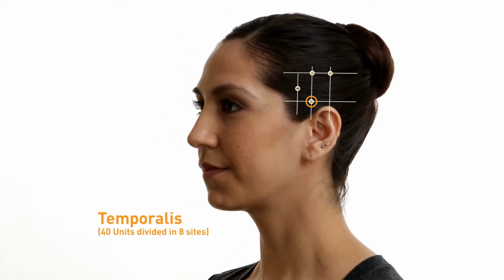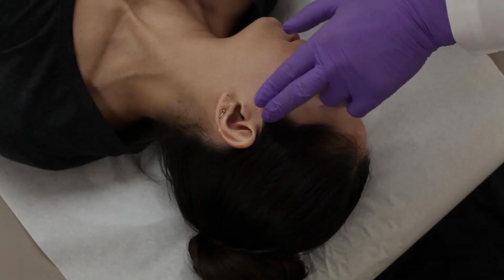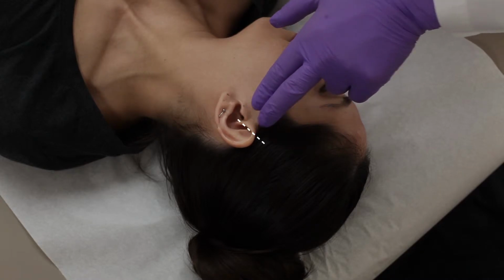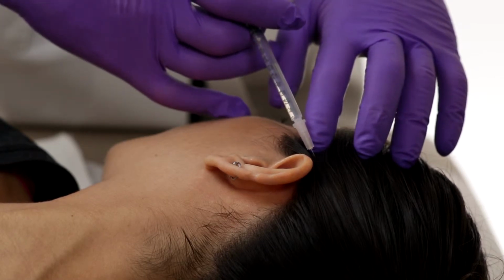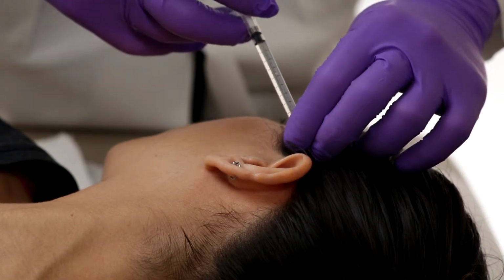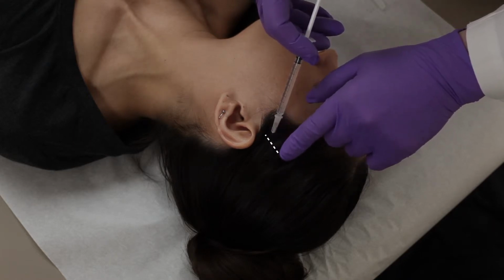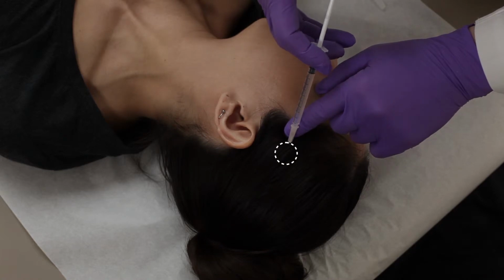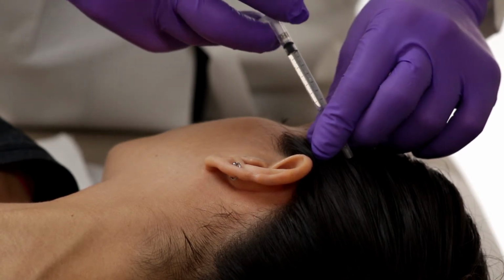To locate the first injection site, find the tragus of the ear and move your finger vertically up the side of the head approximately 3 centimeters or 2 fingers' breadth. Keep the needle superficial and pointed at a 45-degree angle to avoid the periosteum. Stabilize the hub of the needle and inject Botox at the first site. This lines up with a vertical line through the tragus. Move approximately 1.5 to 3 centimeters or 1 to 2 fingers' breadth up from the first injection, still in a vertical line with the tragus of the ear. Once your finger is approximately in line with the frontalis injections, stop and make the second injection.